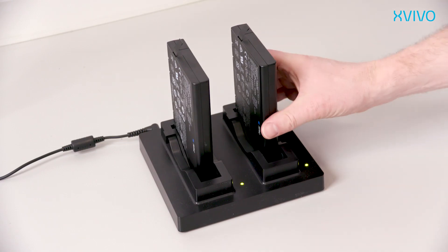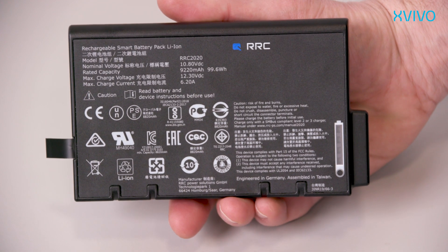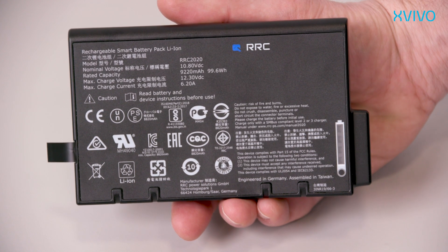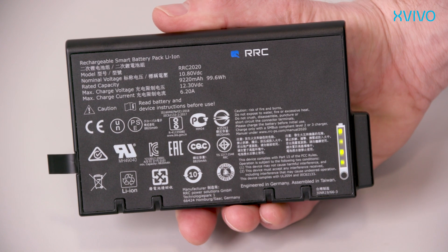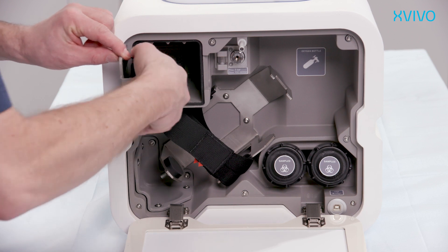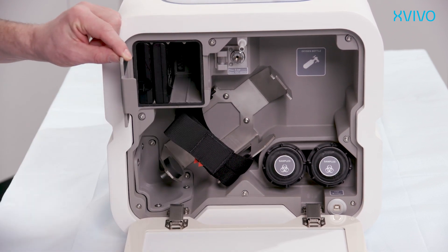Take four fully charged batteries off your charging dock. Check the charging status of each battery by pushing the test button. Four illuminated LED indicators indicate that the battery is fully charged. Slide all four batteries into the battery compartment. After placing the batteries, close the compartment door.